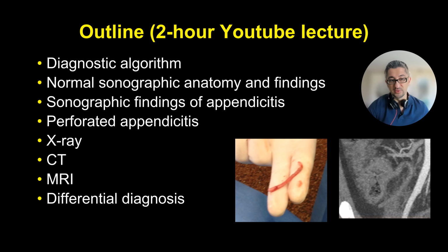Here you can see the outline of my talk. I will start with the diagnostic algorithm. The focus will be on ultrasound, but I will also mention X-ray, CT, and MRI, and at the end I will mention the differential diagnoses. There will be a lot of repetition. I will show hundreds of cases. The repetition enhances the teaching. That's the idea.